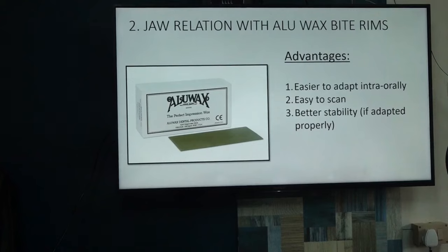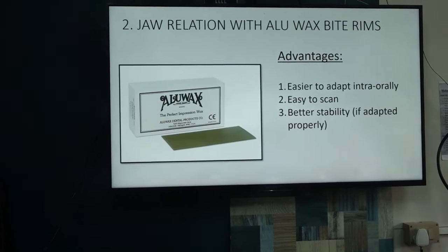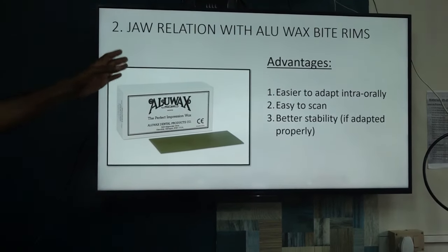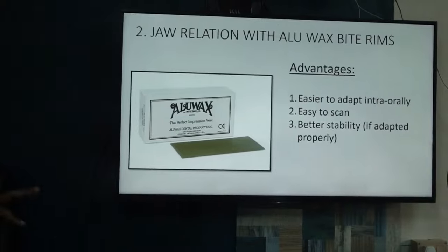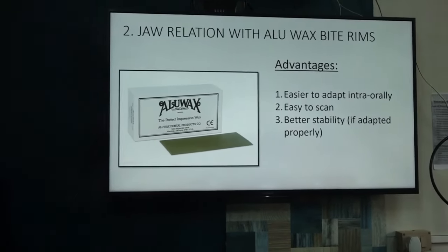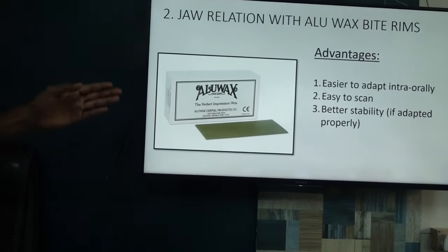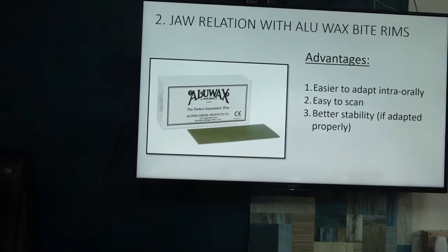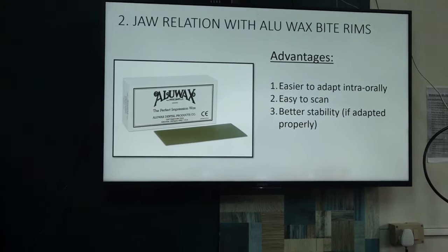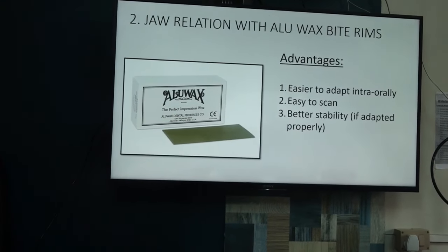So the second step is jaw relation with the wax rims. So how are we going to form the wax rims intraorally only? We'll be using the alu wax, which contains aluminium composition. So it is easier to adapt intraorally compared to the red wax, and it is easier to scan compared to the red wax, and the stability is good compared to the red wax, but only if it is adapted properly. If it is not adapted properly, it will be loose.